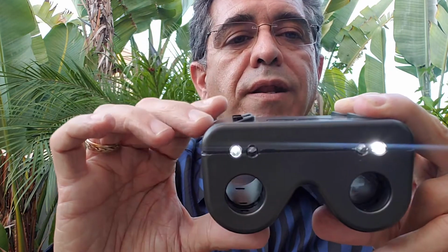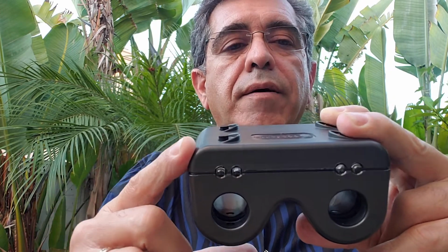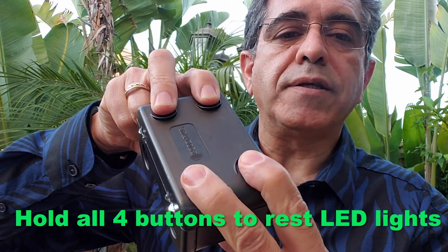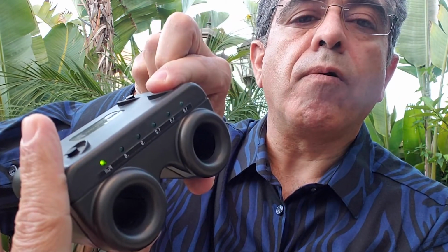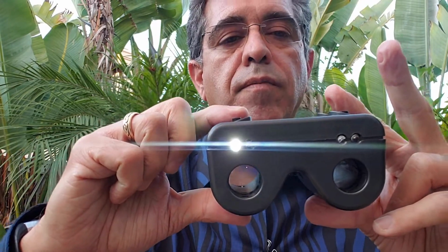And then you would say which eye was the defect in. So at this level, one light is dimmer than the other one. This is dimmer. And you can go back to the normal setting, the previous setting. If you hold all four buttons together, the lights flash, and then both of them are now full. So that's the full original state.